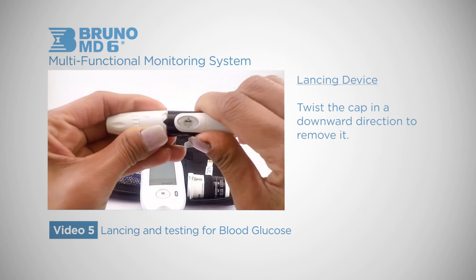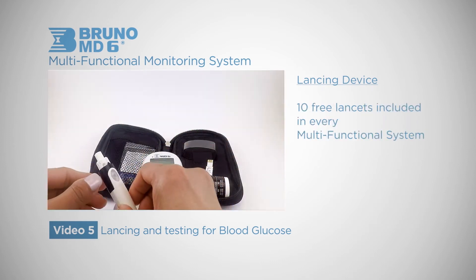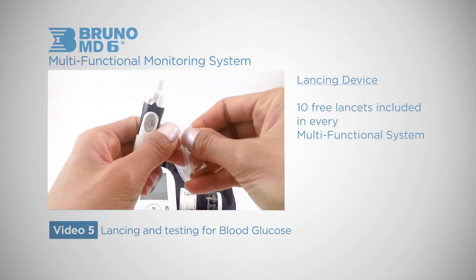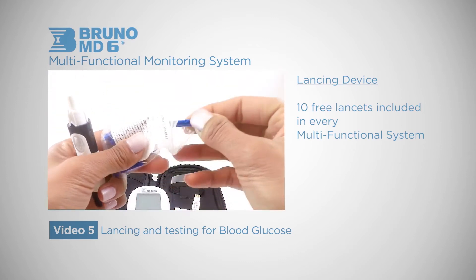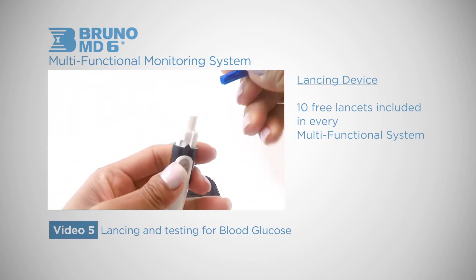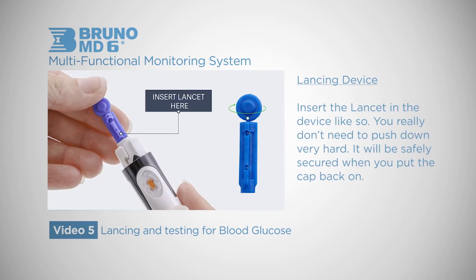The first step is to twist the cap in a downward direction to remove it. There are ten free lancets included in every multifunctional system — grab this bag out of your kit. Insert the lancet in the device like so. You really don't need to push down very hard; it will be safely secured when you put the cap back on.